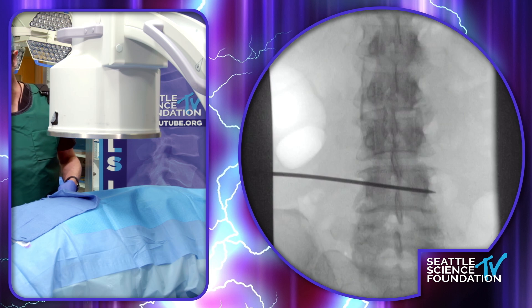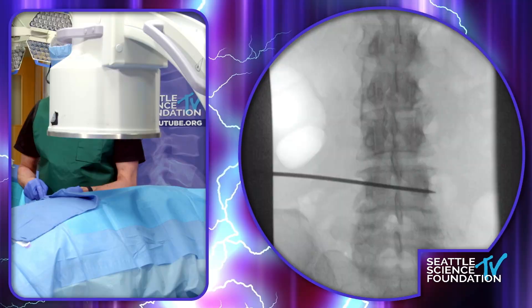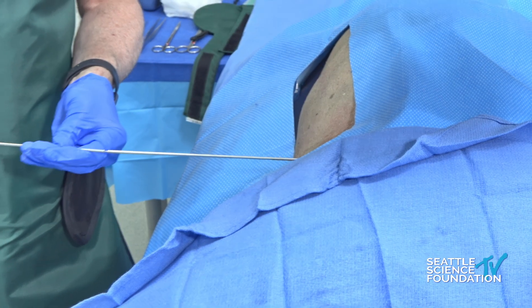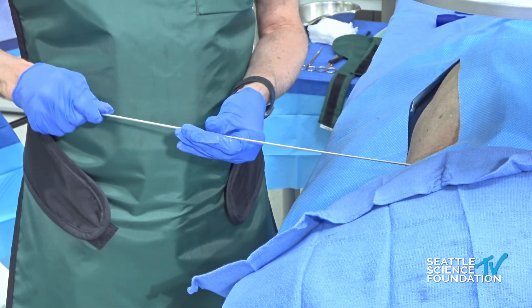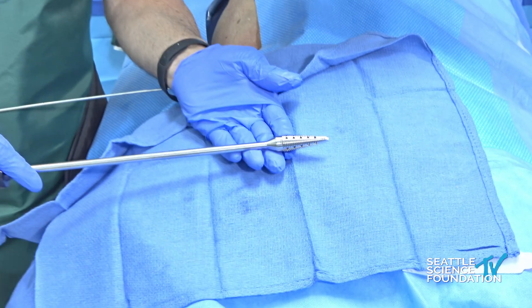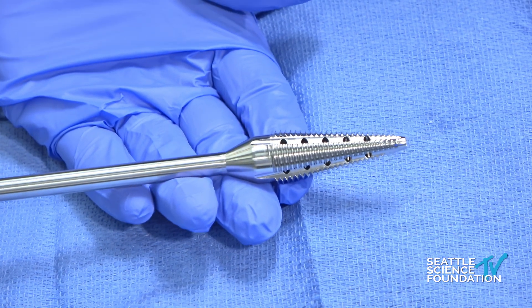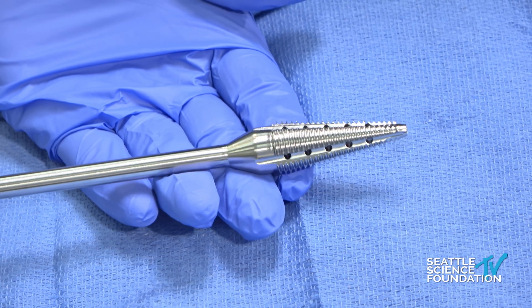Over the top of this, we're going to put on the extender. It's going to fit on the end of this Steinman pin — that's a tapered Steinman pin. We put the extender on because the next step, we have the graduated tap, which has holes corresponding to the 8, 10, 12, 14, and 16. As you can see, this is fairly aggressive — this is a sharp tool. This is a disposable kit that is new and pretty fantastic for a disposable kit.